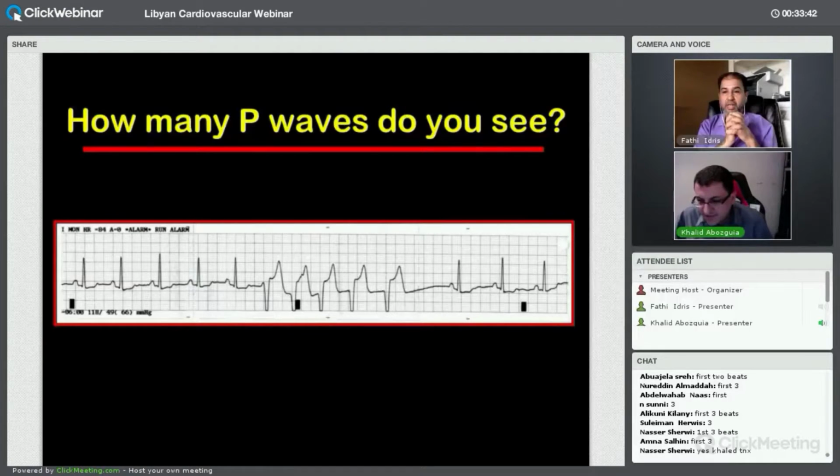Excellent. Just wondering if there is any question. Feel free to ask any question about any of the 3 presentations, or about general EKGs or arrhythmias in general, and we will try to answer them. And again, we apologize. Probably this time we did not anticipate, so we made the cases a little bit complex. But next time we'll have a mixture of cases, some geared for internal medicine residents and interns, as well as cardiologists, because I think we have somebody from all of these groups here.